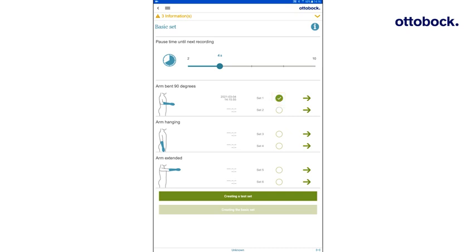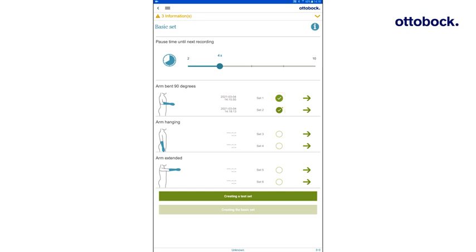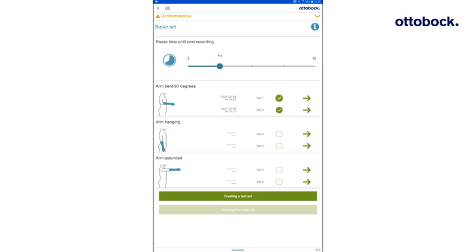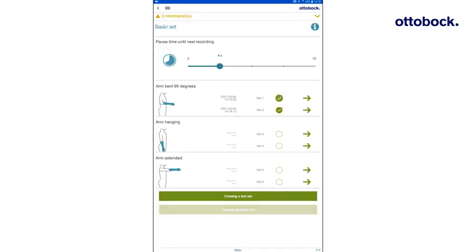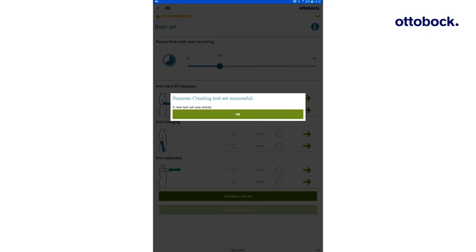Repeat the same recording process for set 2. Once set 1 and set 2 are finished, select both and press creating a test set. This merges set 1 and set 2 to a test set, which is then stored temporarily in the MyoCuff. Keep in mind that the test set is lost after switching off the MyoCuff.